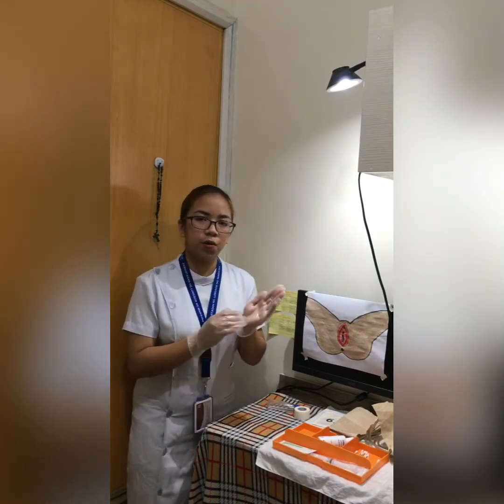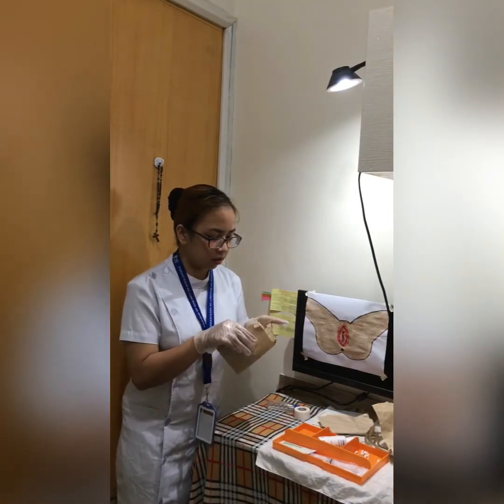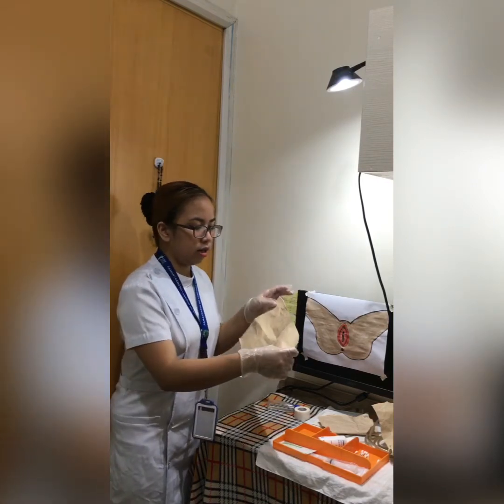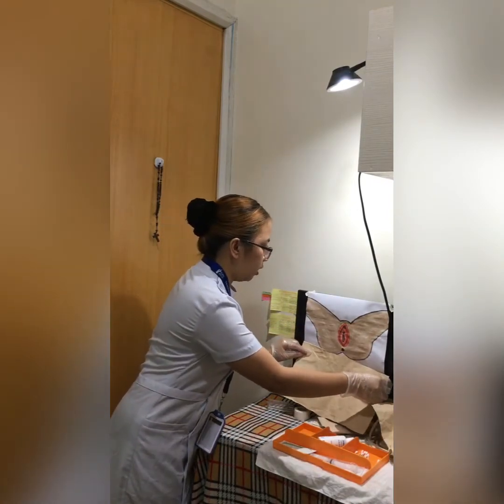Next I'm going to place the drapes under the client's buttocks. I'm not going to touch the center of the drapes to avoid contaminating it with my hands.